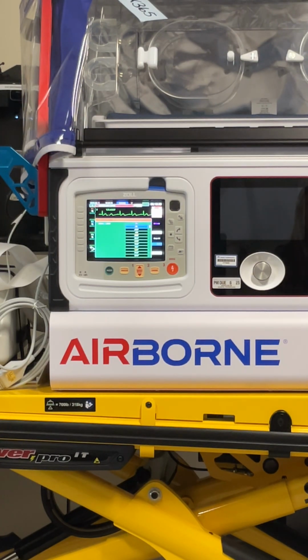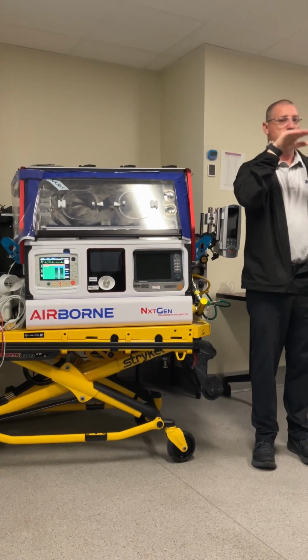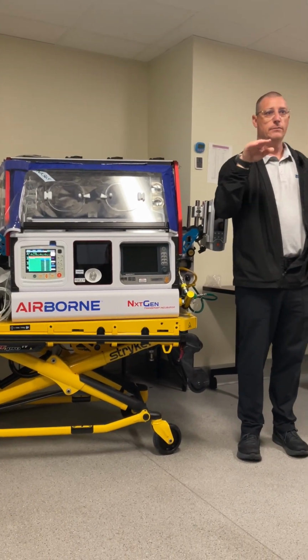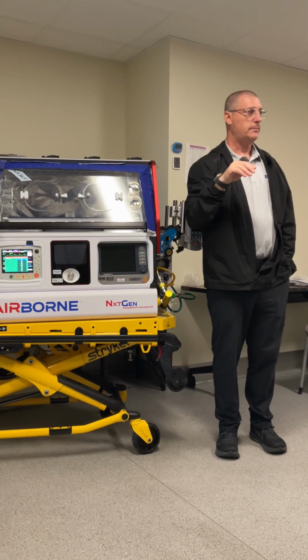If you don't do it correctly, you're only going to get one number. Either you're going to get a number or you're going to get a waveform. You will not get both. So if you only have one, you messed up your zeroing, or you need to re-zero. Make sense?